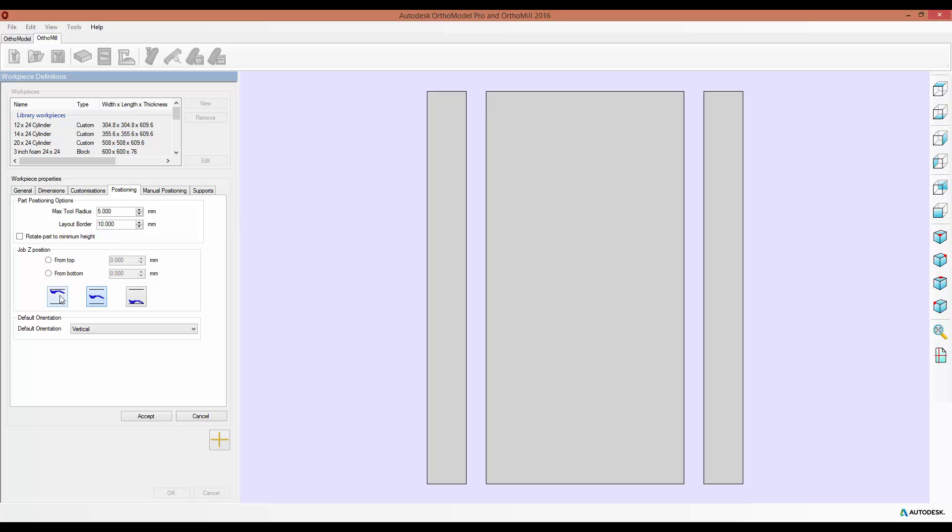However, now you can select to have the default at the top, or at the bottom, or a set distance from the top or the bottom. Now take note that these are only the defaults, and you can still change these for each part that you make.